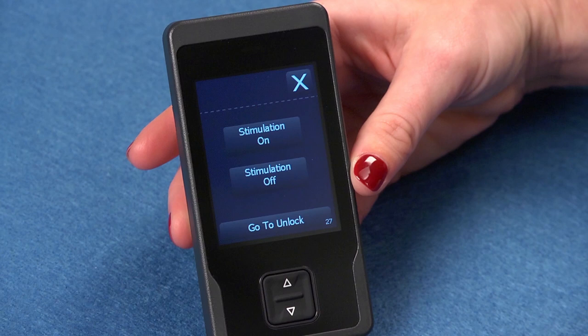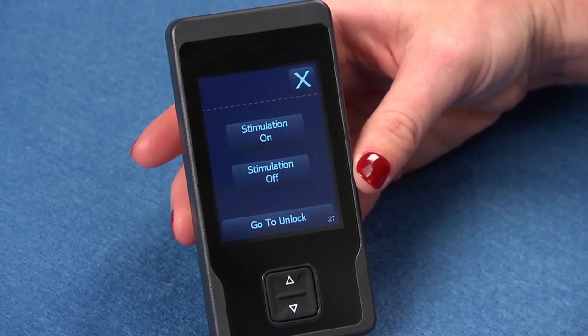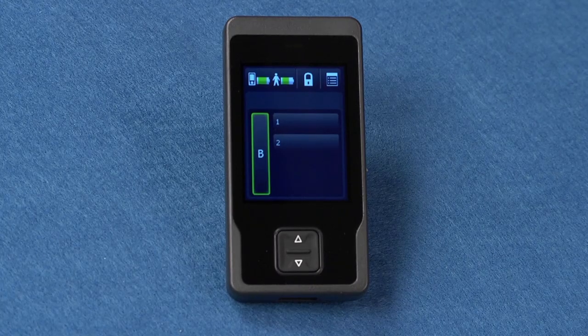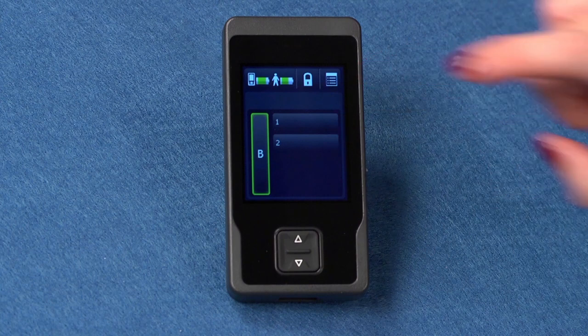Adjusting your stimulation. To turn stimulation on or off for all programs within the same group, press the stimulation on or off button, which is located on the top of your programmer. Press the unlock button if you wish to return to the home screen. The home screen will confirm whether stimulation is on or off. When stimulation is on, the active group will be highlighted in green. To adjust your stimulation settings, press a program button on the home screen.